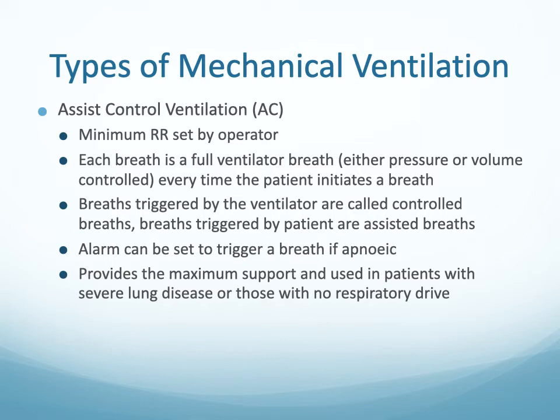So we would use assist control in those patients that have no respiratory drive. Those would be ones that have a brain injury, or snake bites, or neuromuscular disease.